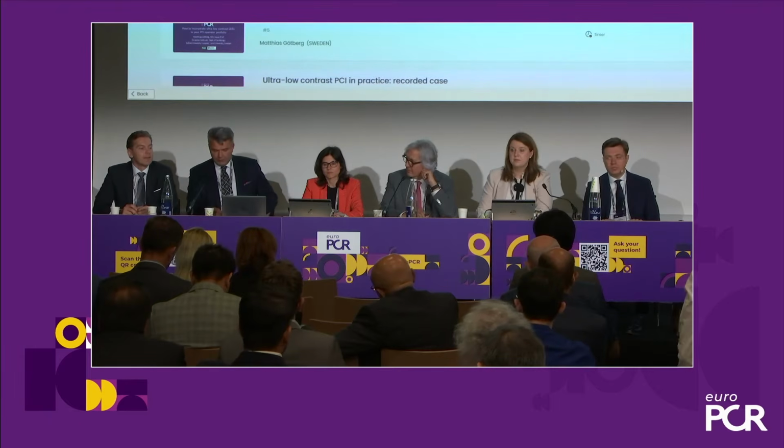Yeah, so I think that as for all interventions, it is better to start with elective cases to be well prepared and trained, but finally you can go for acute myocardial infarction. And as I mentioned, many patients are not referred for interventional treatment due to CKD and acute MI, but if they know that your lab and you are experienced, they will refer easily. So starting from elective, going to acute, certainly it should be our focus.